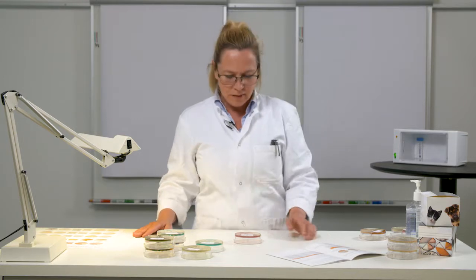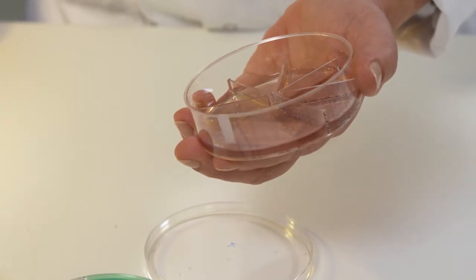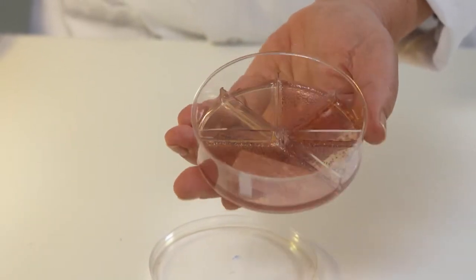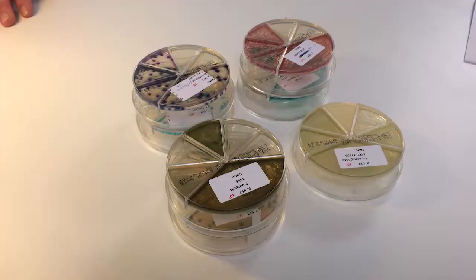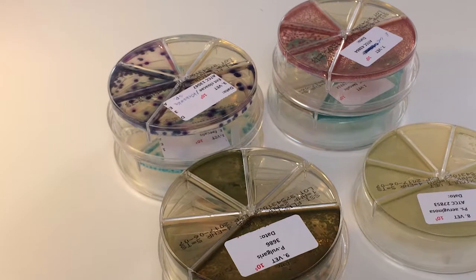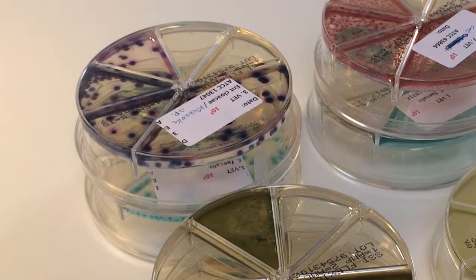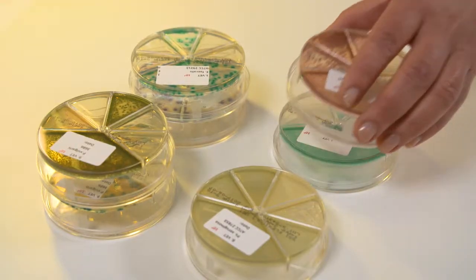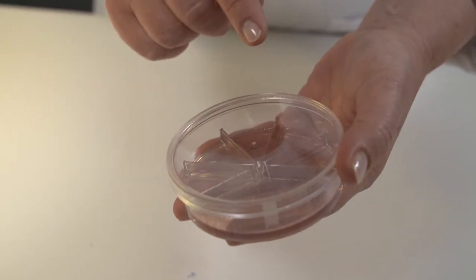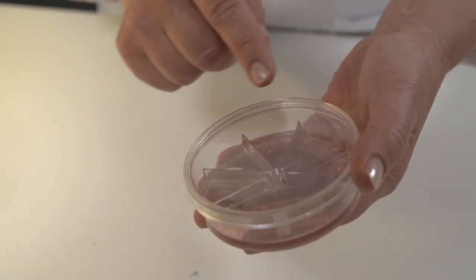After incubation is completed, the plates need to be read, and good light is important when reading the plate. Flexicult vet plates contain a chromogenic substrate, which allows you to identify various urinary tract pathogenic bacteria. The chromogenic substrate makes it possible to establish the enzyme activity in the bacteria. The agar and the colonies will appear in different colors. This enables you to identify various urinary tract pathogenic bacteria. And the growth, or lack of growth, of bacteria indicates which antibiotics can be used for the treatment.